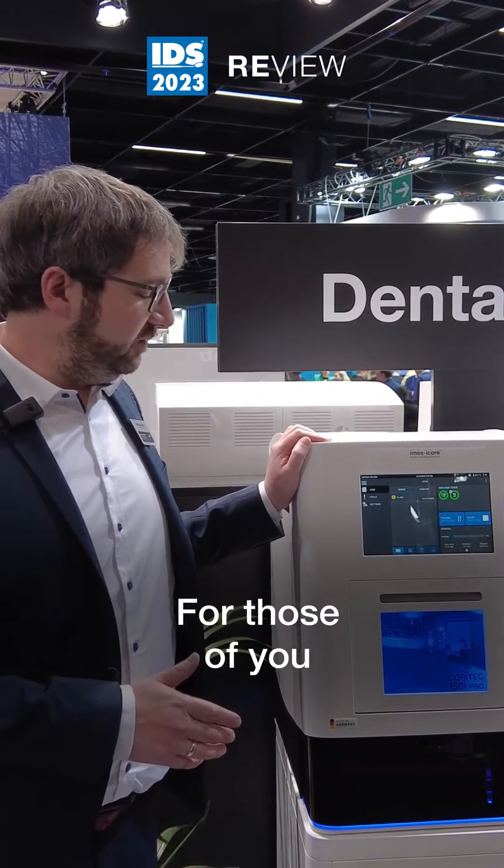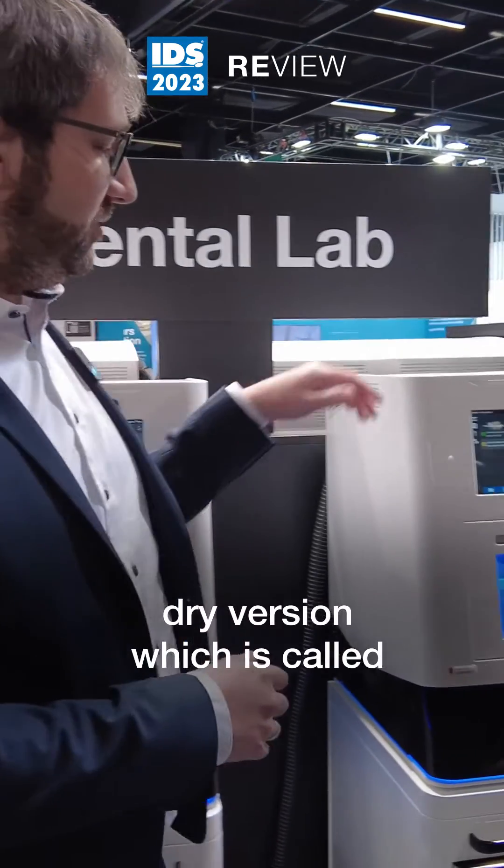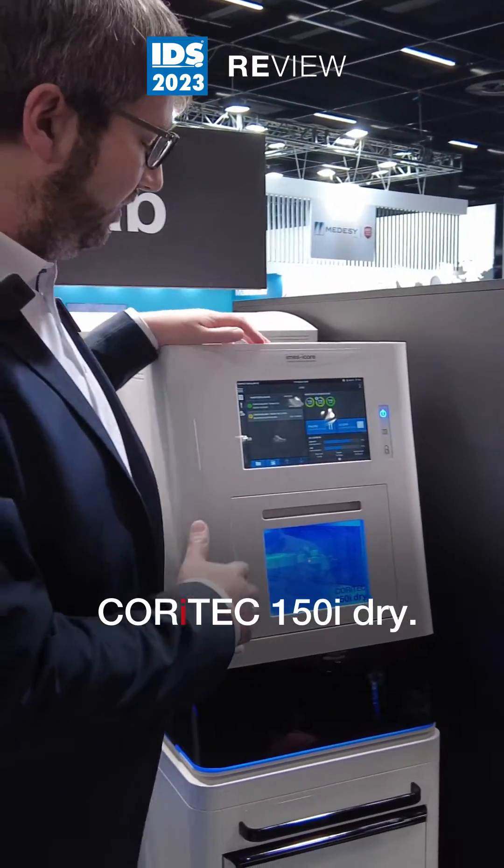For those of you that don't need the wet milling, we also offer this machine as a dry version, which is called the Coretec 150i Dry.